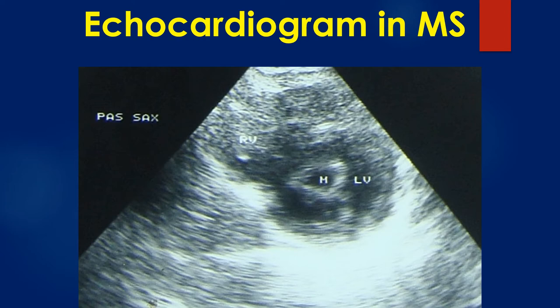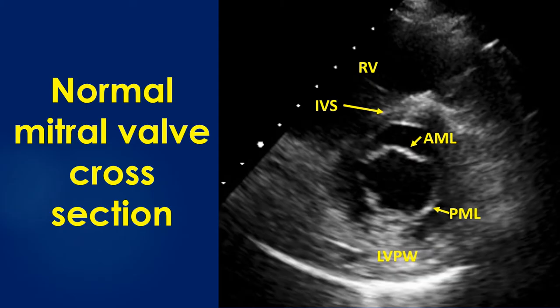The parasternal short axis view in mitral stenosis shows the fish mouth appearance of the mitral orifice in cross section. A normal mitral valve cross section is shown for comparison, with anterior and posterior mitral leaflets widely separated. Scallops of the mitral leaflets are also visible, more clearly in the posterior leaflet.